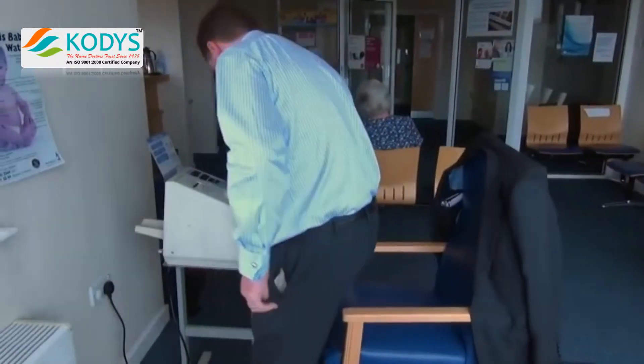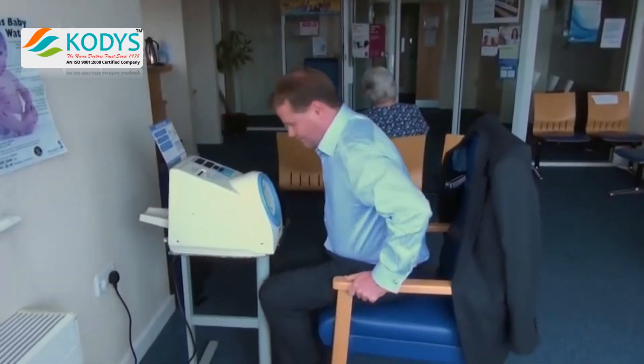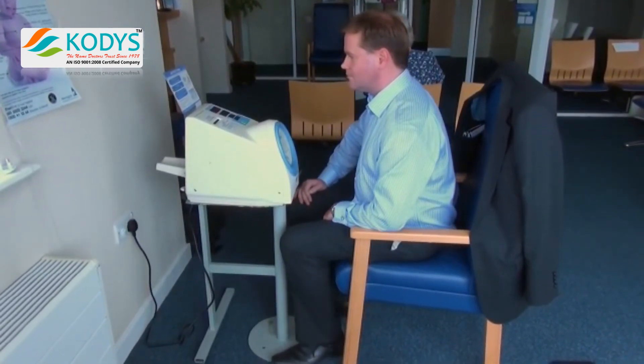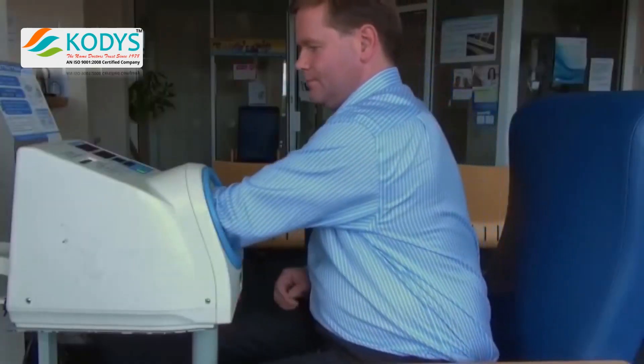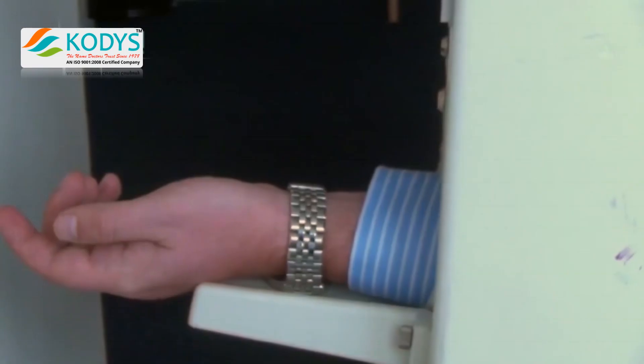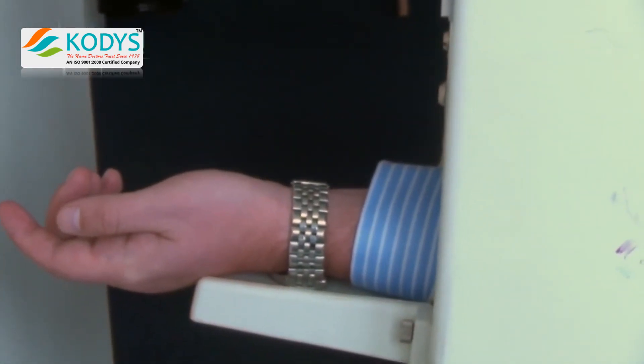The patient should sit for a few minutes until they are feeling relaxed. Sit in an upright yet comfortable position with both feet flat on the ground. When comfortable and relaxed, place the arm inside the machine, ensuring the elbow is approximately halfway in and the palm of the hand is facing upright.